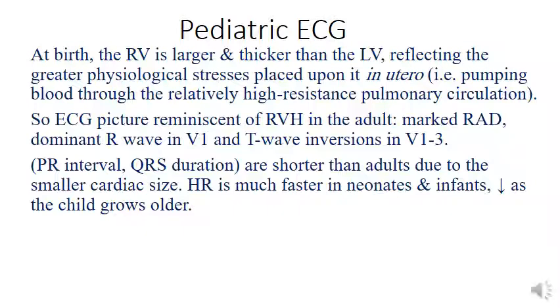Today we start the lecture on pediatric ECG according to the schedule. So you see here in the first slide, the pediatric ECG differs from that of adults in the following criteria.